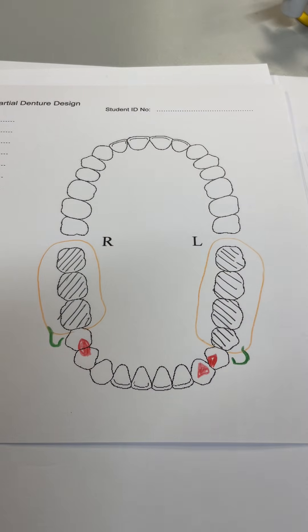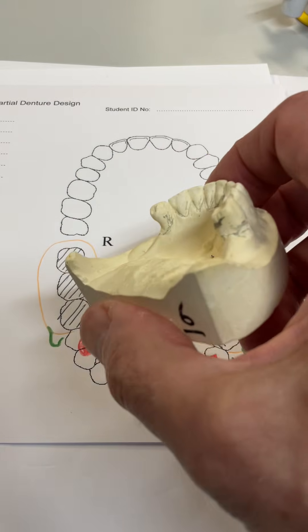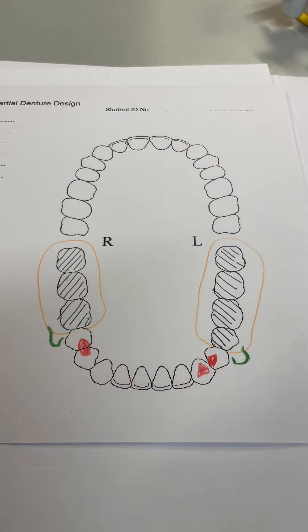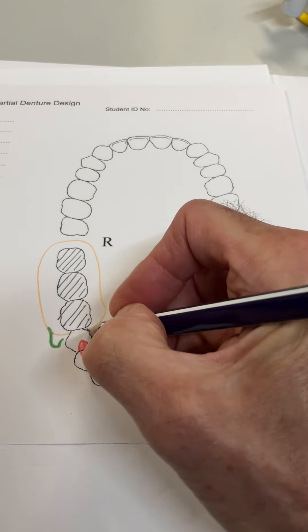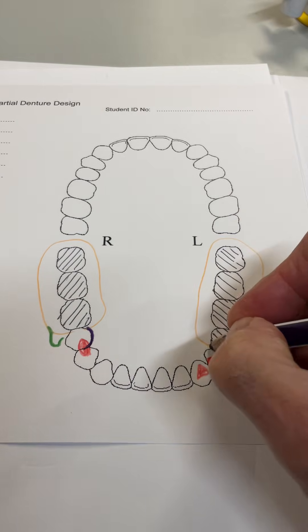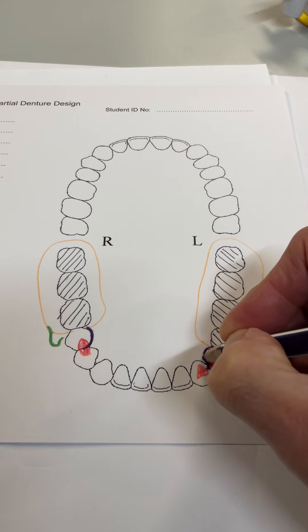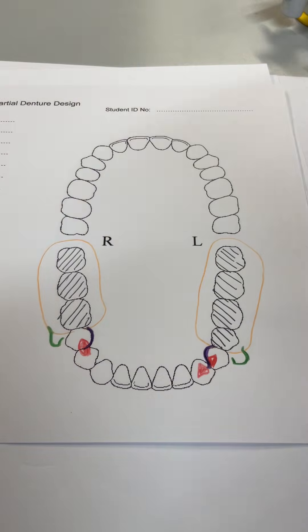Now we need to reciprocate. Clinical crown height is very good on both these premolar teeth, so there's no reason why we can't do arms to keep it gingivally free. I'm going to bring an arm around here, and that will link both those rests to the denture base. I'm going to bring an arm around here, which will also link there. So we've got arm reciprocation for those two teeth.